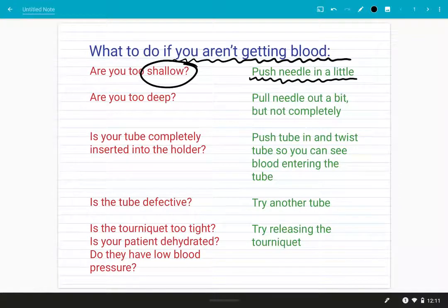You don't want to hit any nerves, tendons, or arteries because that can be painful and it can cause injury. If you think you might be too deep — maybe you jostled the needle a little bit when you put in your tube — you can try pulling your needle out a little bit, but make sure you don't pull it out completely because in that case you're probably going to get a lot of blood everywhere.